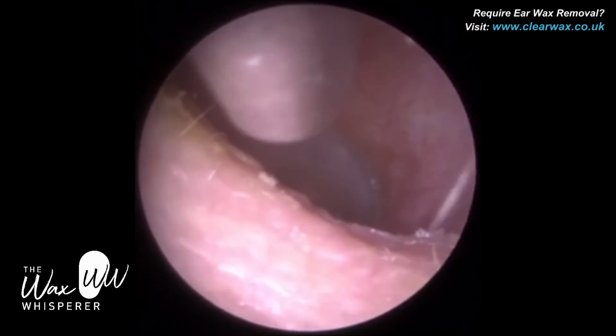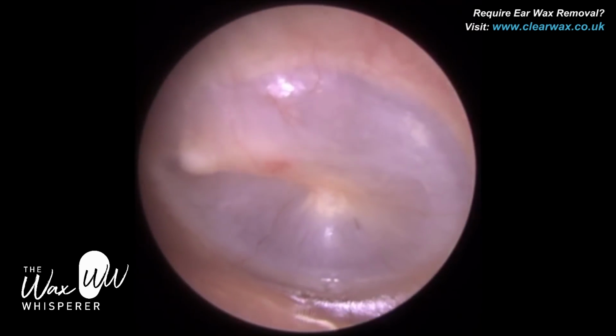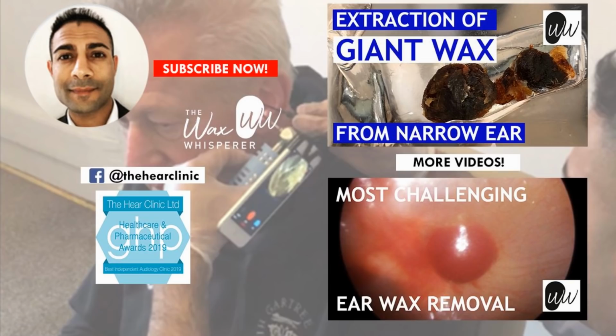So this is the second bend where the suction probe is, and I just touched that. That's the second bend. And that's the tympanic membrane. Look at that view. I'm still sometimes taken aback by the view with an endoscope. I did a lot of my training with an otoscope, and when I first looked through an endoscope, it literally changed my career, if I'm honest.